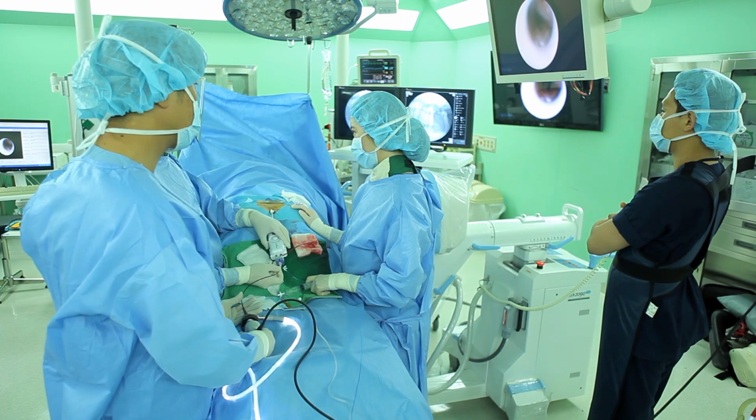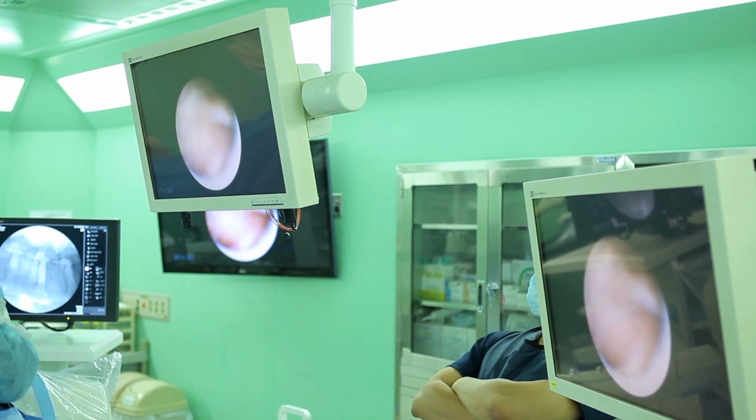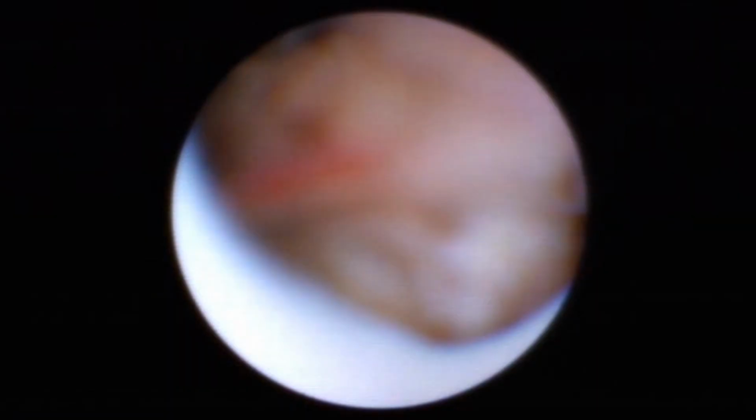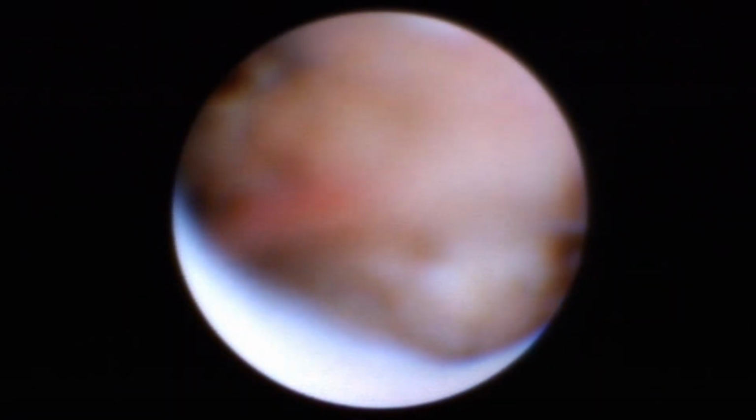Disc particles coming from firing the laser come up as a full white view, which may be compared to a blizzard. The more blizzard, the more favorable the prognosis.